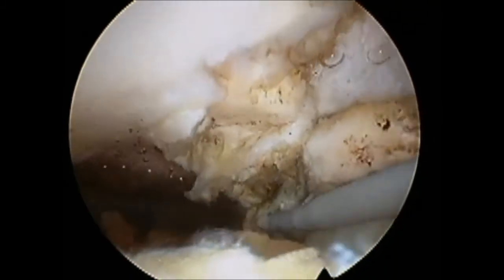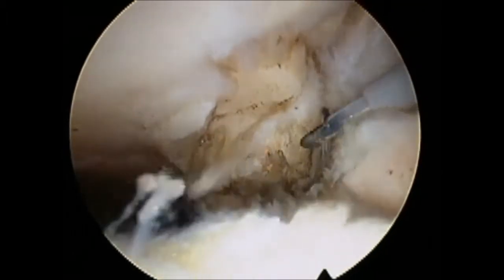Once the fragment has been adequately mobilised, it's easy to remove it with a grasper.